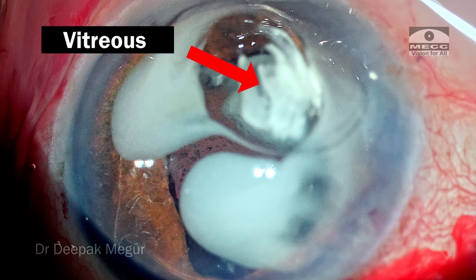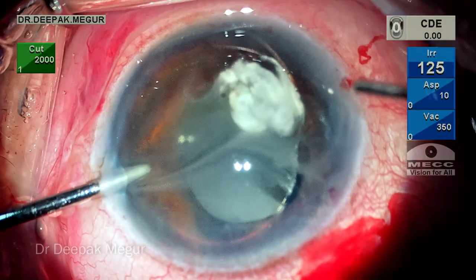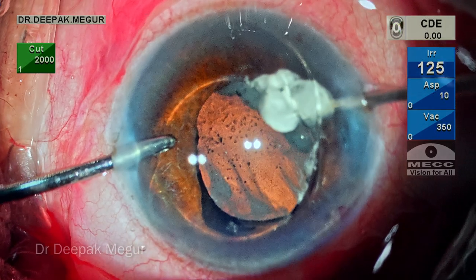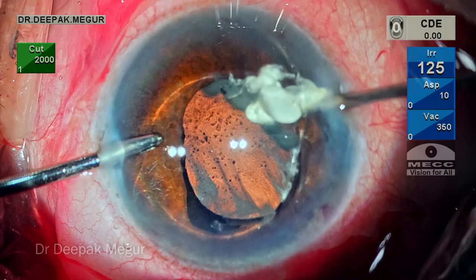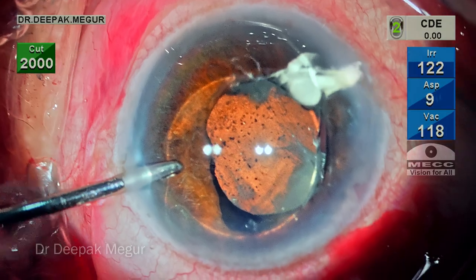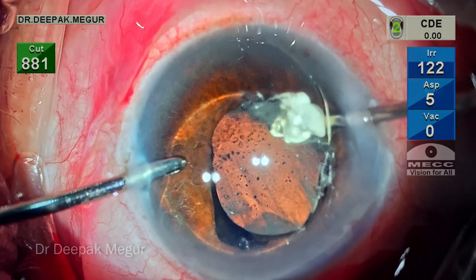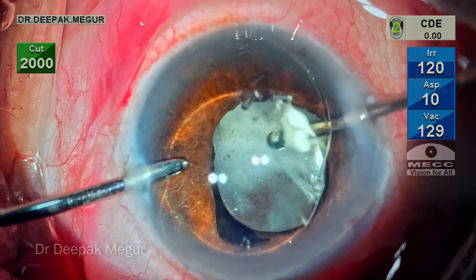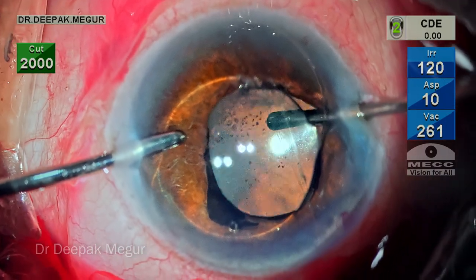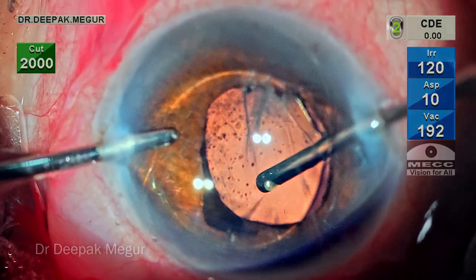It's quite dramatic to see the vitreous blob which was not at all evident there. We can see the vitreous is hugging the lens in fact. If we had pulled the lens just like that without acknowledging the presence of vitreous, it would have induced significant traction on the vitreous base. Identifying the vitreous was probably the most important step in this surgery. With the irrigation in my left hand, I go in with my cutter and deal with the vitreous which is trying to come through the side port. Then the bevel of the vitrector is turned down and I perform an anterior vitrectomy. In a couple of minutes, the vitreous which is around the lens is cleared off.